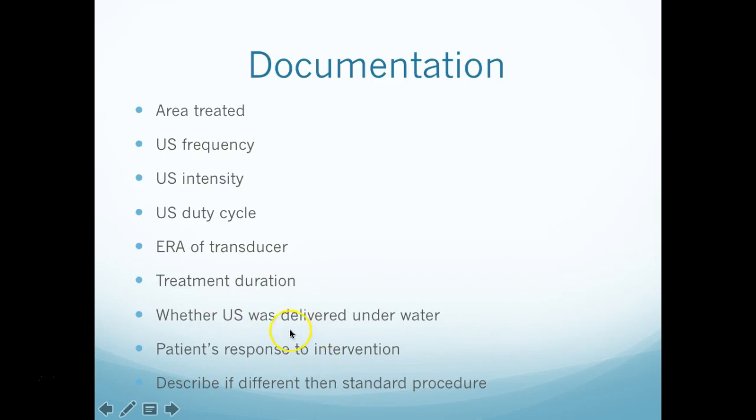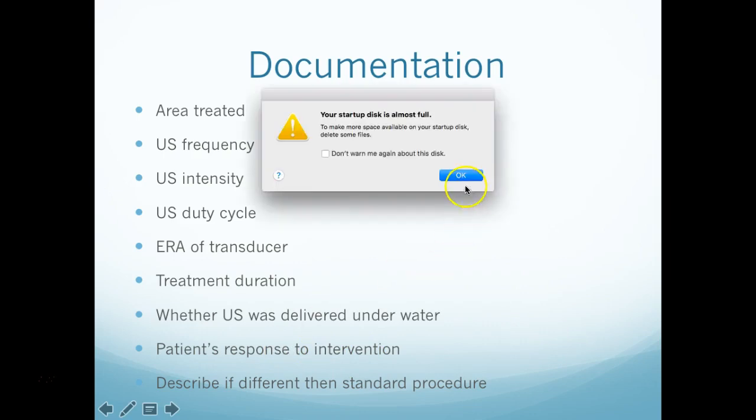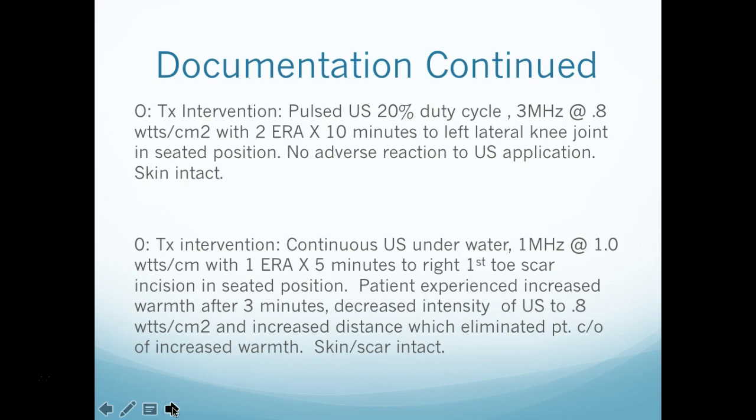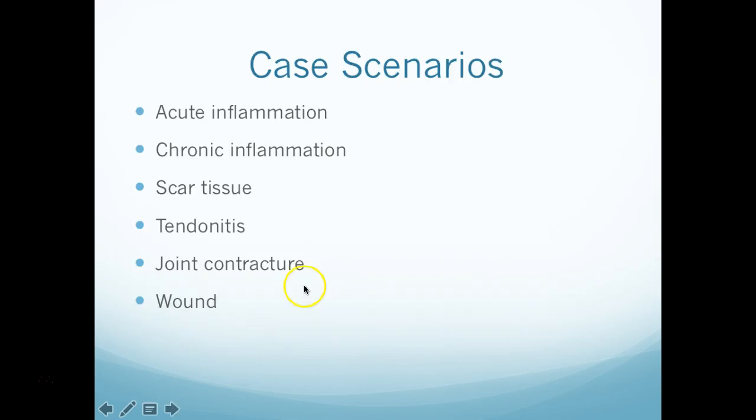You want to know whether the ultrasound was delivered underwater, and their response to intervention. We always want to do that under our SOAP note to know whether it was beneficial for them. Of course, with all of these, you're always going to check the skin, and then describe if different than the standard procedure that somebody would normally use. Okay, so here's just an example of those. And then I would encourage you to go look at the case scenarios in your Cameron book.